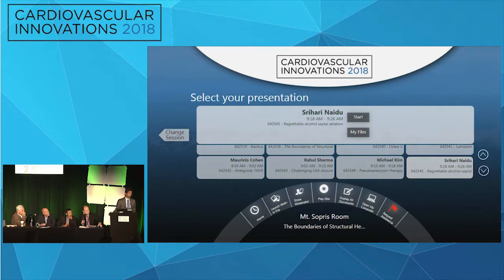So we take these people now that come in with real VSDs and put them on an LVAD and just decompress them for 6 weeks. Now, if you can wait 6 weeks and it's easy to fix, right. If you have to fix it, then we still decompress them some way. Yeah. Now, I know this was earlier. But then the question is, how long do you wait? I mean, really, you have to wait weeks, right? For this.